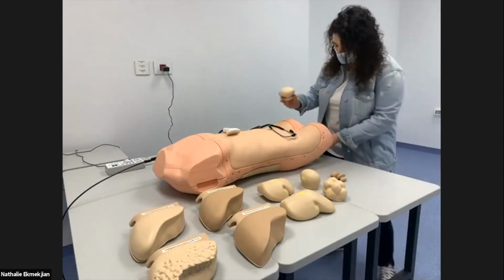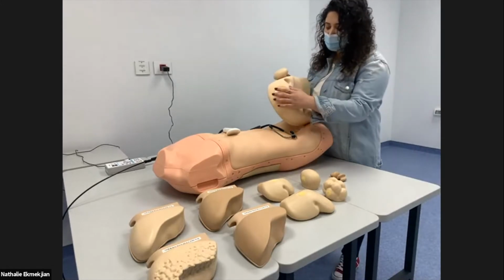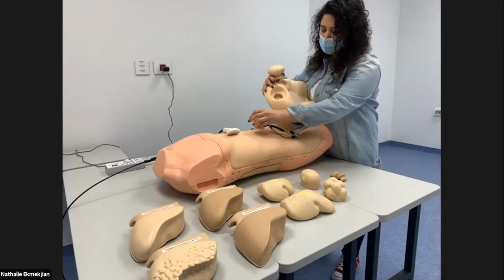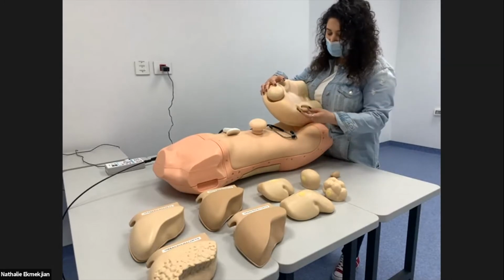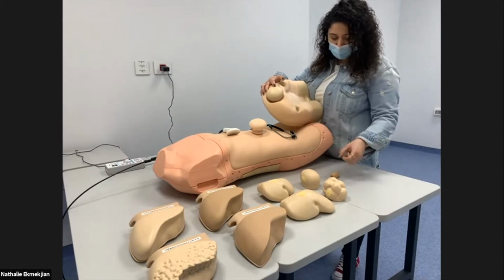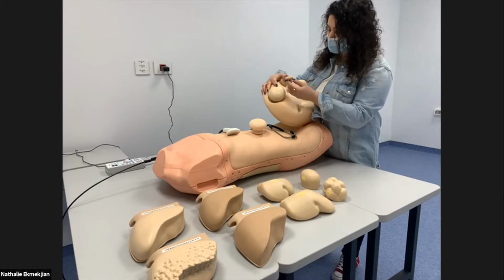This is the uterus. So we have the normal one. We can remove the normal uterus and place the fibroid uterus. Along with the inguinal lymph nodes, we have one normal, and this one is lymphoma.